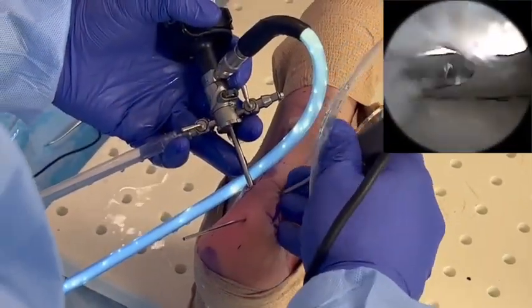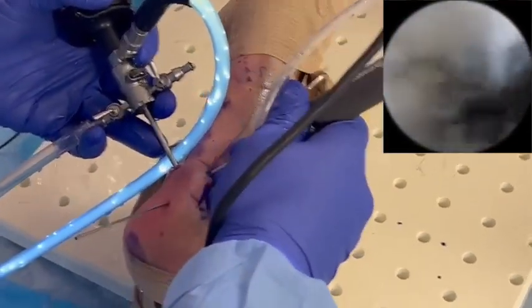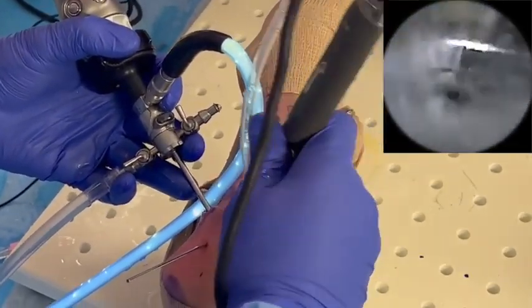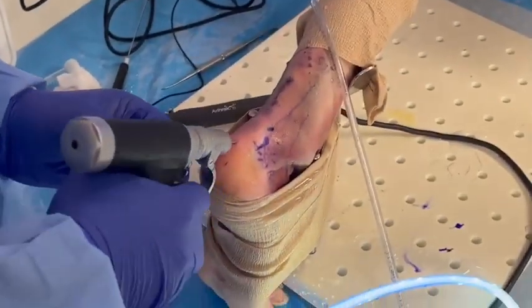A shaver or burr is used to resect the deformity, ensuring thorough removal of both osseous and periosseal layers to minimize the risk of recurrence. At the conclusion of the procedure, dorsiflexion and plantar flexion of the ankle are performed to assess smooth gliding of the tendon.